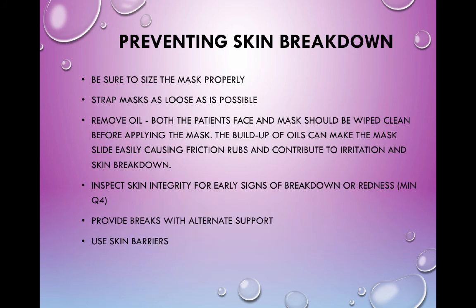So also preventing skin breakdown. We have a lot of issues with skin breakdown because of the nature of the device. So in addition to making it loose, we want to make sure it's the right size mask. And so hopefully we size it correctly. Sometimes we may have to try a couple different masks as loose as possible. We talked about that. Removing oil.